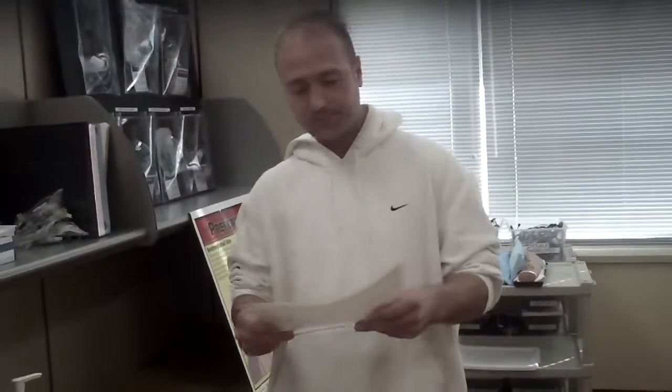My name is Jesse, and this is intradermal injection. First, I would have my MAR, and I'd have the doctor's reason for the injection. Today, we will be giving Mr. Smith 5 units of TB for his TB testing. I would come to my cart, perform hand hygiene.